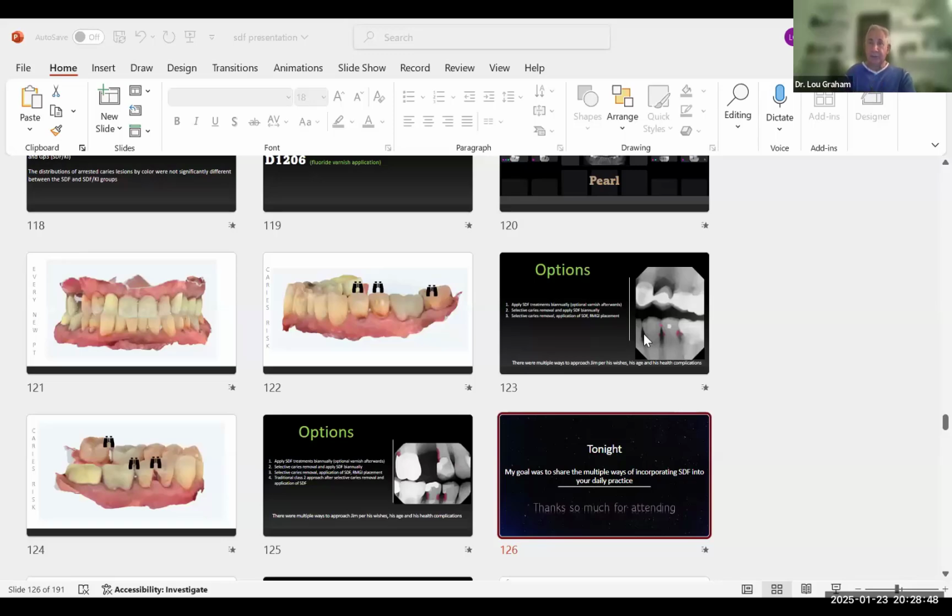I routinely can use a curette to remove some of the leathery affected dentin. That's up to you. That is totally up to the doctor who asked that. I just find I have better dexterity using these Comet burrs. Also with the burr, you're using a force at 1,000 to 2,000 RPMs. You're just basically stroking that tooth and you'll see the shavings come off. I just think it's more accurate than just a curette. But a curette you can absolutely use.